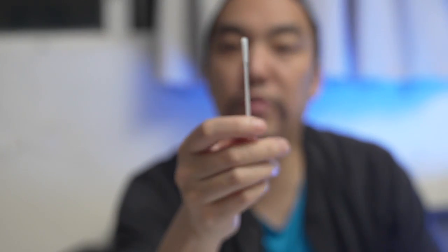So you got to shove it up both nostrils and like wiggle it around to get all the COVIDs stuck to it. So I guess I'm going to do that now. I better get a nice close-up. Ready? Alright.